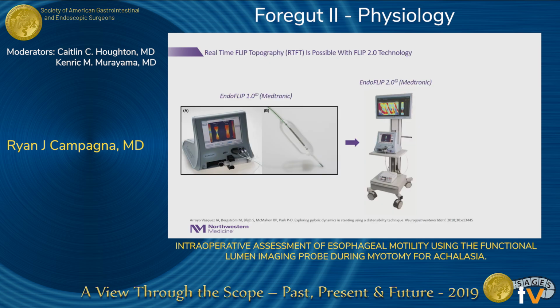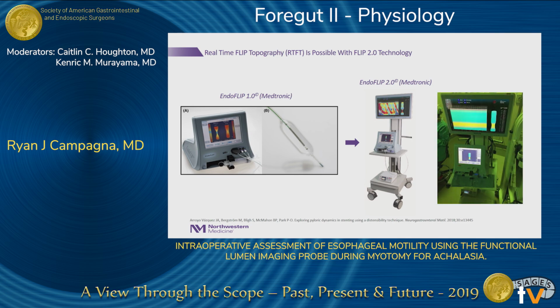So as we've seen, we can now take this technology and see FLIP topography in real time. And this is through the EndoFLIP 2.0 unit. It utilizes the traditional EndoFLIP console, but it has a portable monitor that has software integrating this data to make FLIP topography in real time. And this is our unit under the green operating room lights.